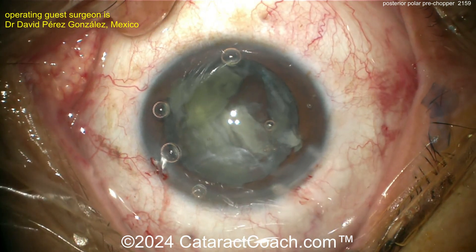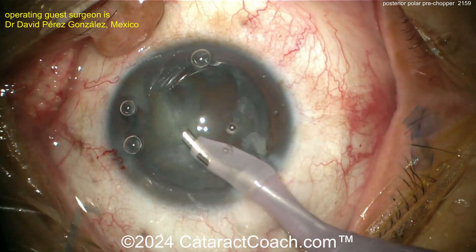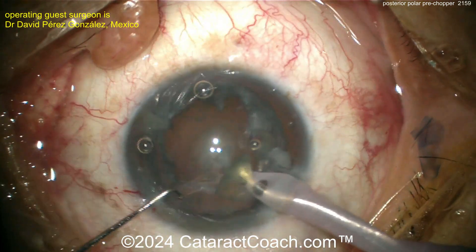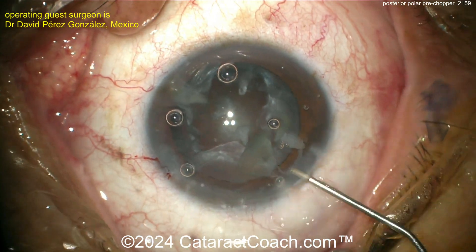More viscoelastic is always a good idea. Notice there's no real rotation of these pieces — bring them up out of the bag. There was no hydrodissection. Now getting the last of the endonucleus out. What remains is the epinuclear shell and the cortex, and you can still see the posterior polar opacity.